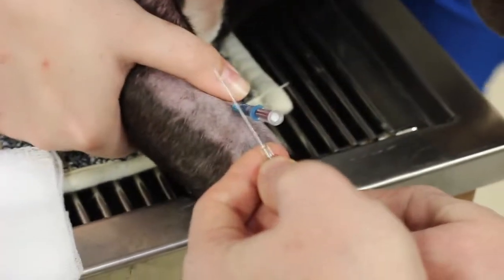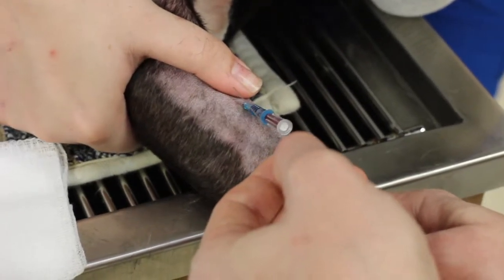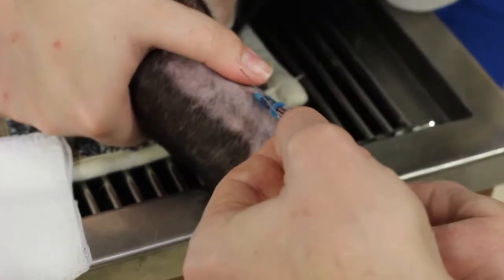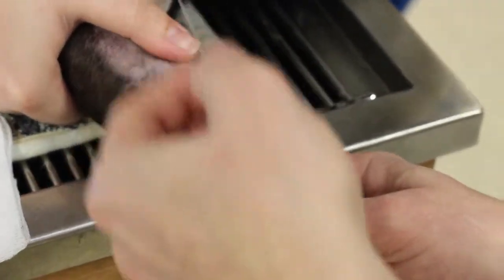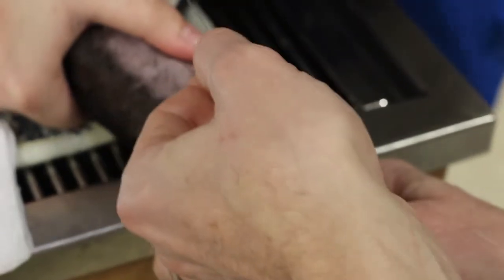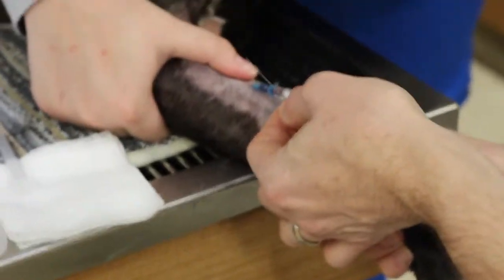One of the tricks with this stylet is — in a perfect world, you never push it back into the catheter. When you pull it out, you're pulling it out. Because when you try to thread it back up if the catheter is halfway in, you can puncture the catheter or lacerate a piece of the catheter off while it's inside the dog. You don't want to do that.